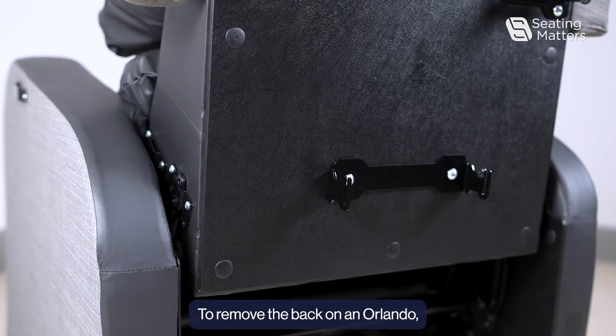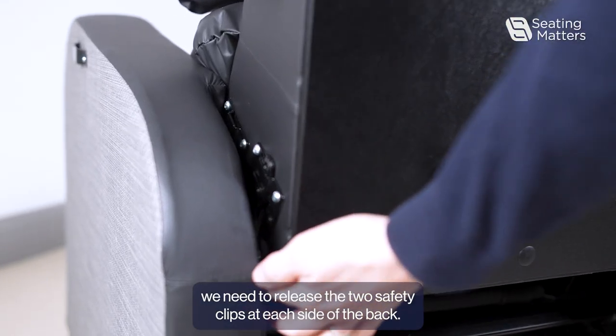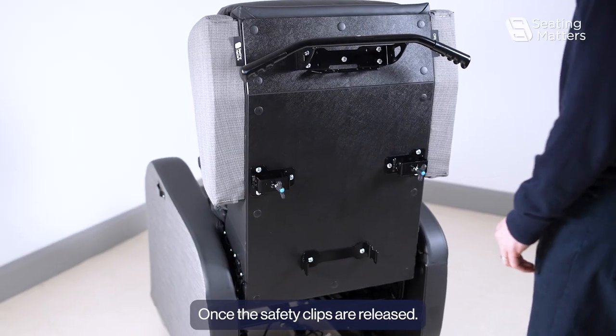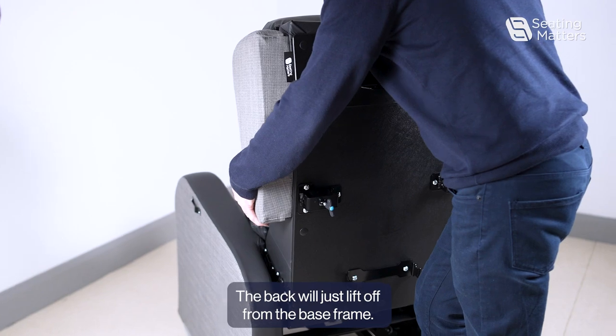To remove the back on an Orlando, we need to release the two safety clips at each side of the back. Once the safety clips are released, the back will just lift off from the base frame.